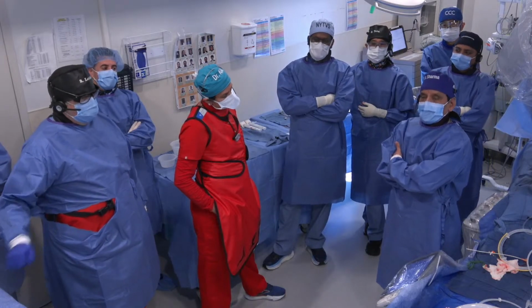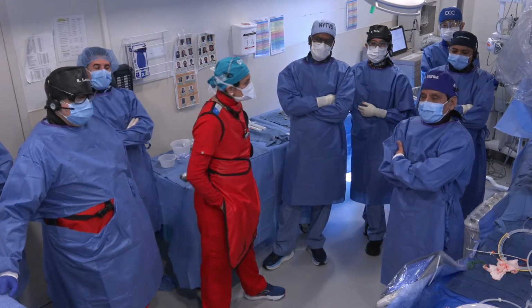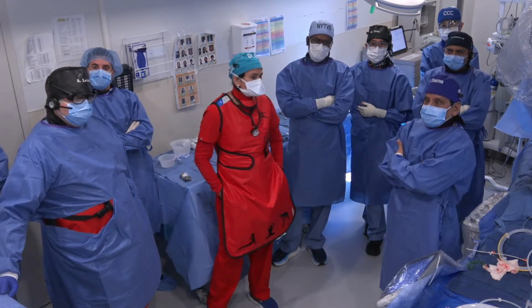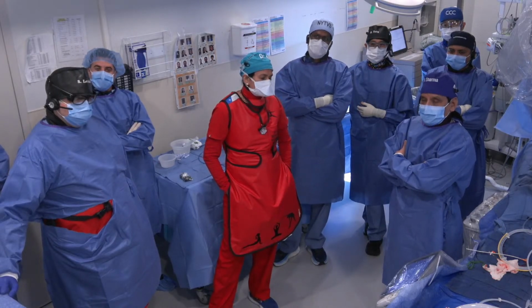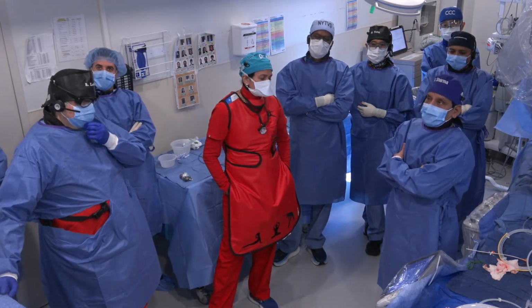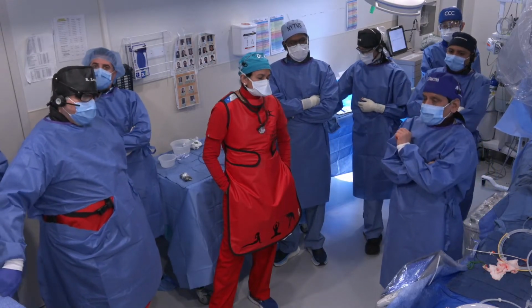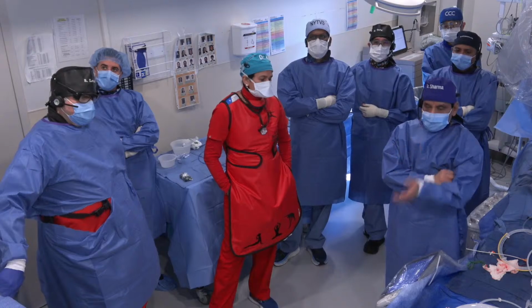We have seen many of these, even in mitral valvuloplasty, using IVL to fracture calcium. So it's not far away, but a lot of things are being planned at present: what can be done to delay the progression of aortic stenosis, and secondly, prevent the degeneration of the TAVR valve. I think all these things will continue to evolve.